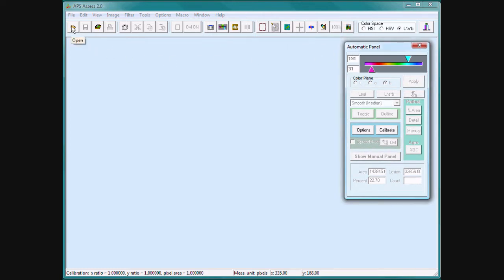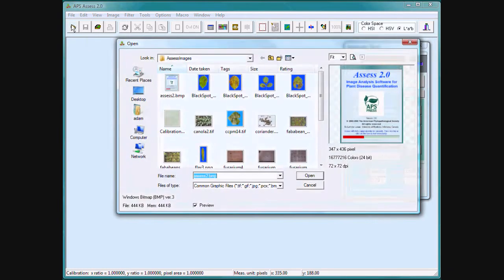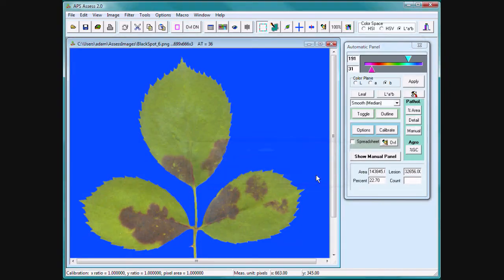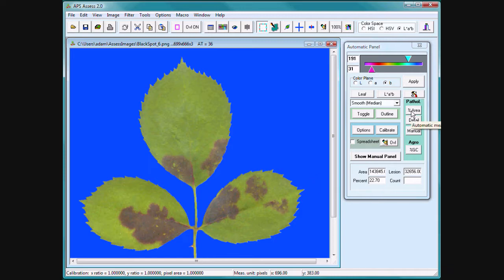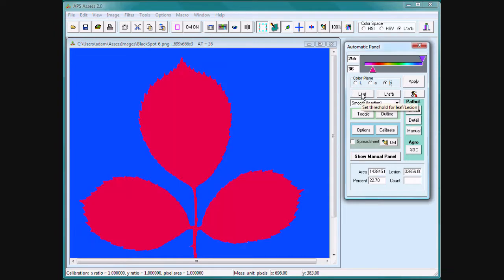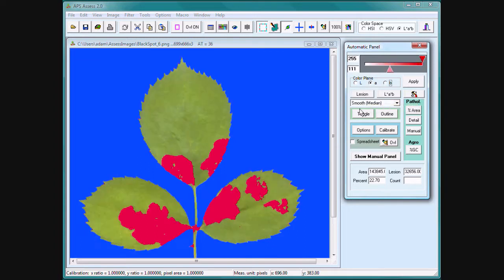Open an image that contains a uniform blue or white background, green leaves, and lesions that are any color other than blue, white, or green. Press percent area and Assess instantly calculates leaf and lesion and percent infection.